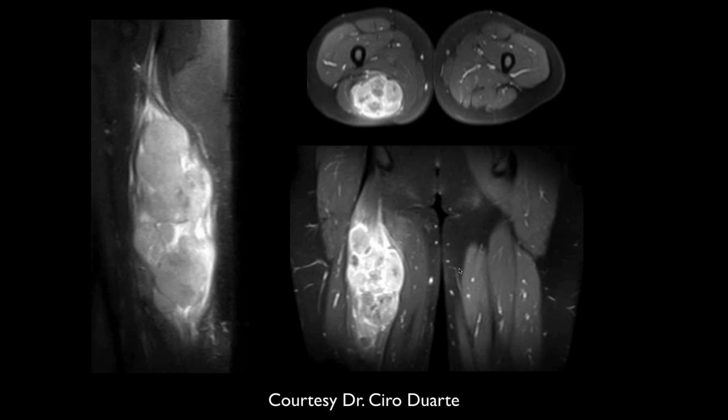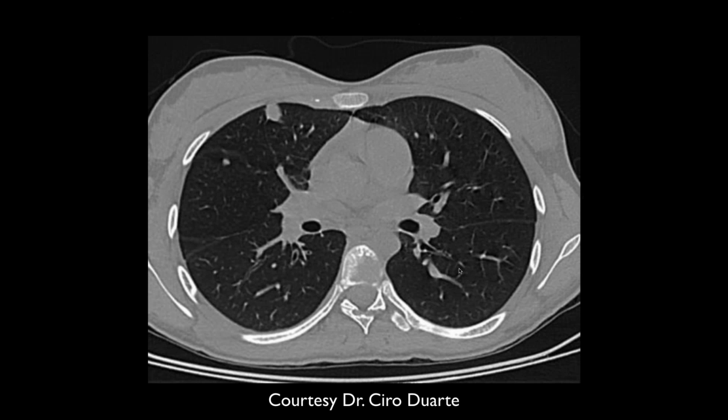It's growing within that compartment fairly aggressively. A lot of mass effect. The margins are fairly sharply defined, but I'd still be quite concerned for malignancy, and now she's got lung mets. Let's see, one, two, at least two. Soft tissue. Okay, gotcha. Interesting.